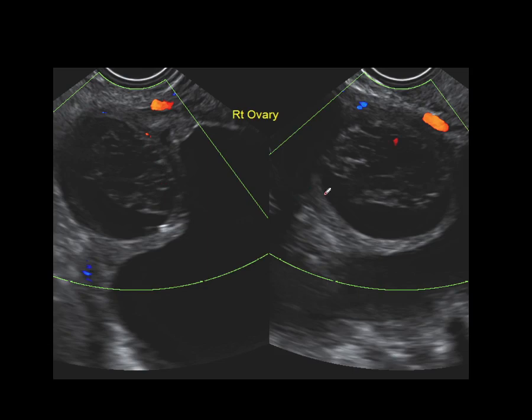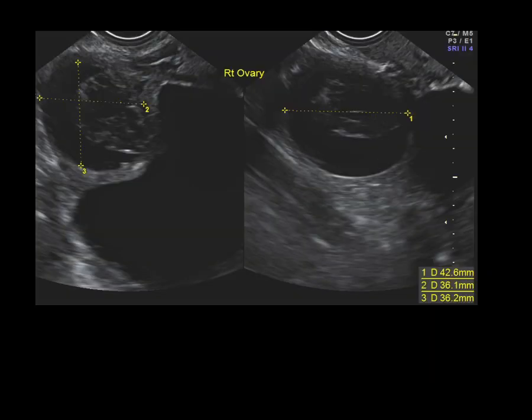Again, as I was emphasizing earlier, very important to look at the border. You can see a nice smooth border to this cyst all the way around. These are the classic appearances of a hemorrhagic cyst. How big was this one? 43 millimeters.